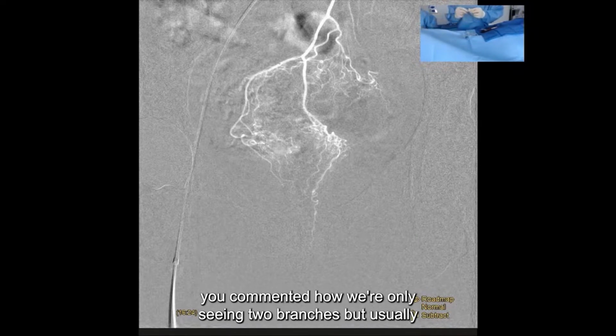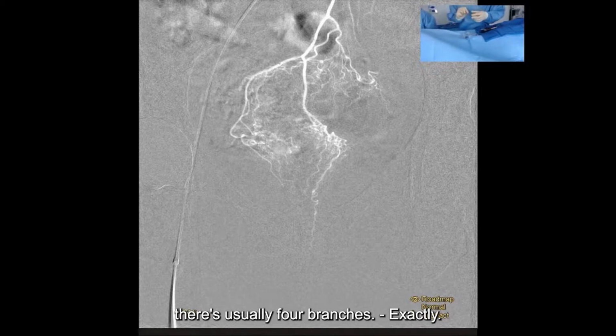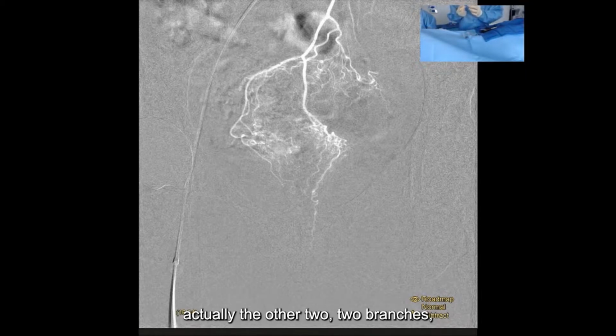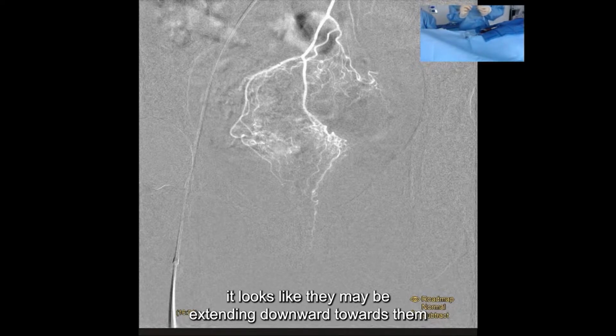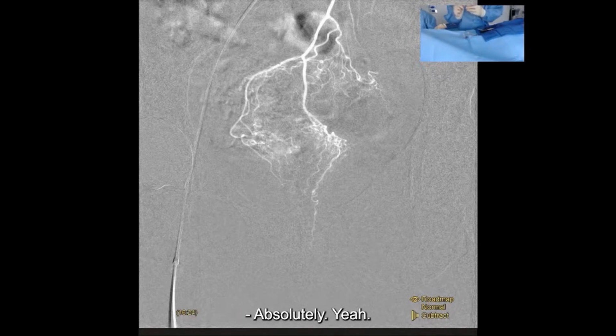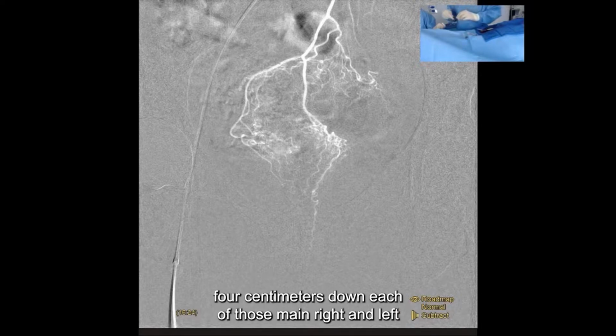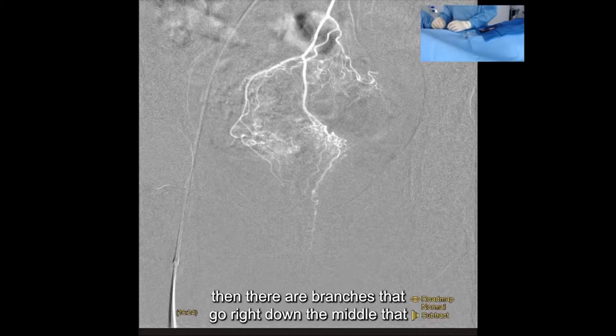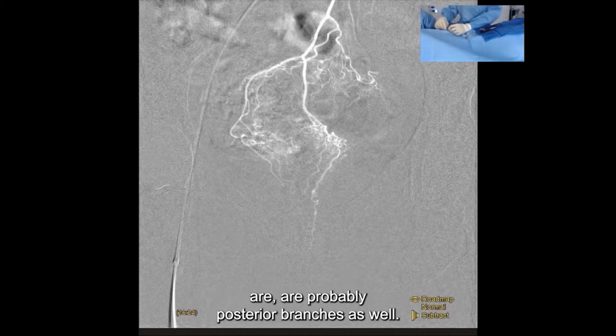So on your previous angiogram, you commented how we were only seeing 2 branches, where there's usually 4 branches. Exactly. So do you think in this image that proximal branch is actually the other two branches? It looks like they may be extending downward towards them. That proximal branching point. Absolutely. Yeah. So once you're right, 4 centimeters down each of those main right and left trunks, then there are branches that go right down the middle that are probably posterior branches as well.